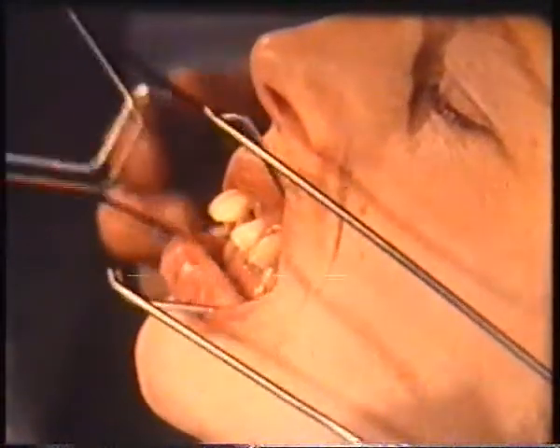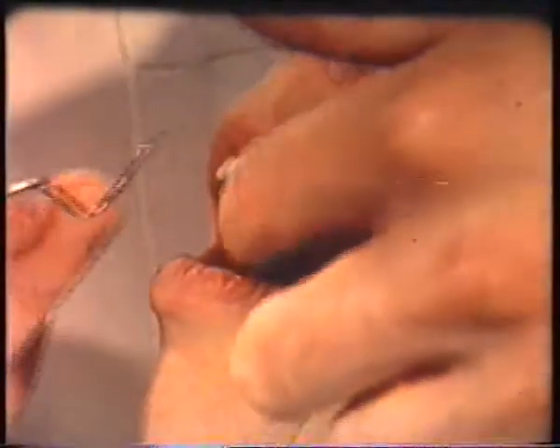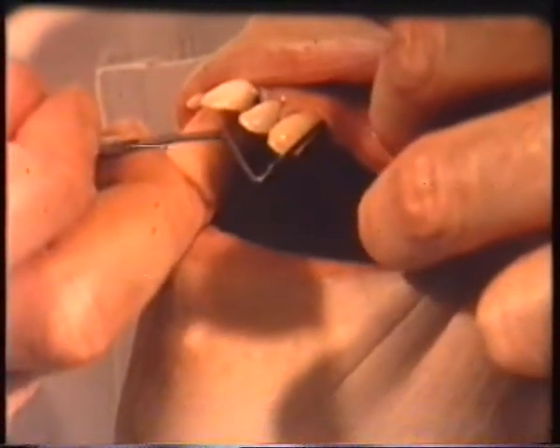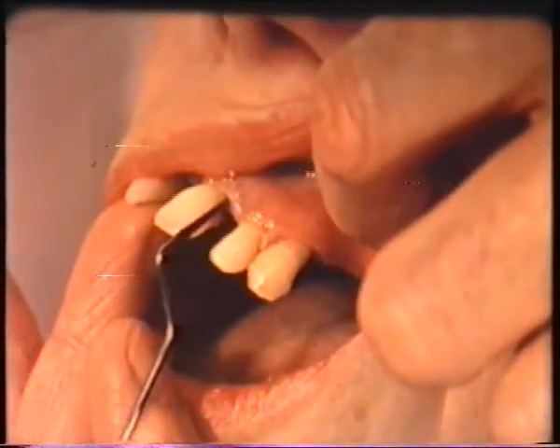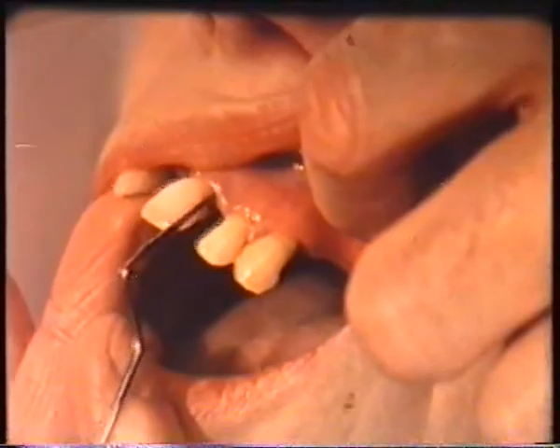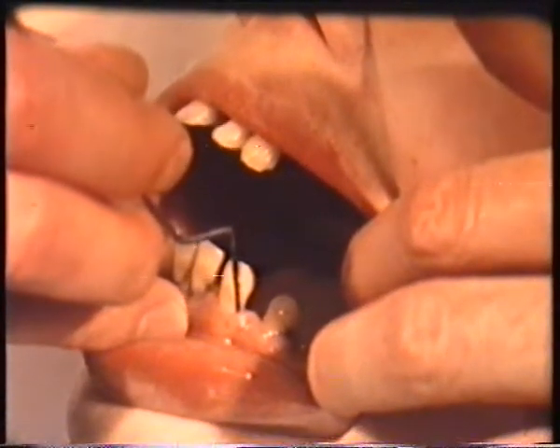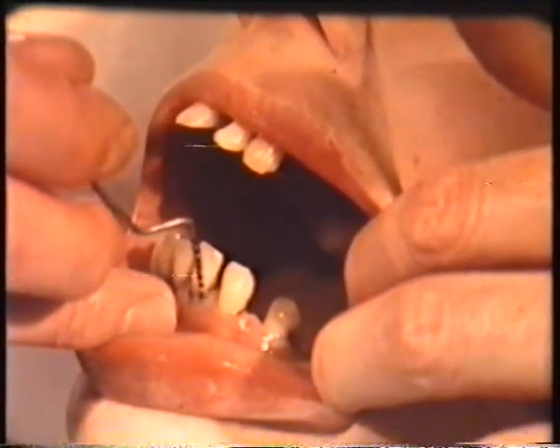Consequently, when the dentures are made, the position of the upper anterior teeth will be altered to modify the degree of protrusion. Measurements of the depths of the periodontal pockets must be made so that the amount of alveolar bone resorption can be estimated. The dentist will then know how much more bone should be removed by alveolectomy in order to reposition the teeth and accommodate anterior labial flanges.